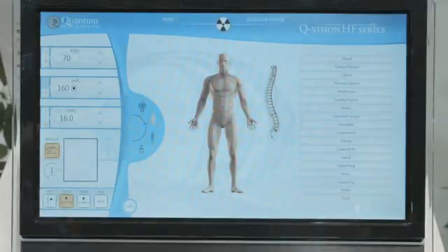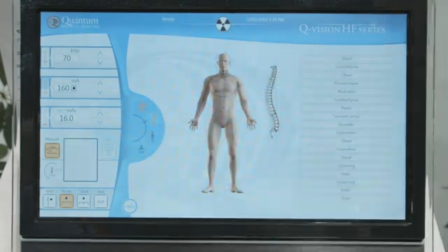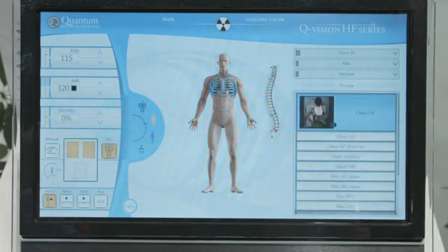As an example of the simple operation of the QVision generator, here we can select from our patient size — small, medium, or large — and we select the anatomy. In this case, I'm going to choose a two-view chest. Here we can select the chest and select the PA view, and we're ready to expose.